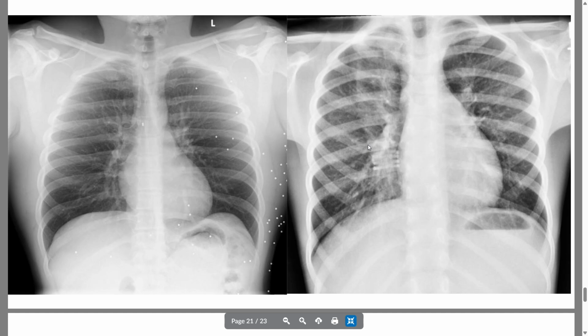We've seen a bunch of things that have a similar shape that could be metallic surgical artifacts, things like that. But in this case, the patient actually has their hair down in a braid, and this is a hair tie. Whenever they have super long hair, super dense hair, or it's braided, it's most likely going to show up on the x-ray. So we always have them put it up as high as it'll go, so that it's not impacting our study, especially on a chest.